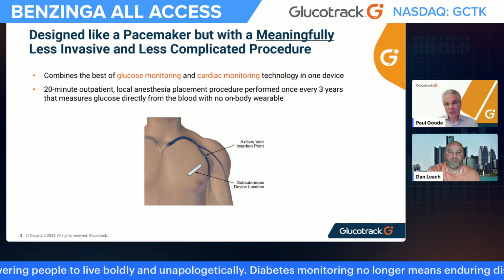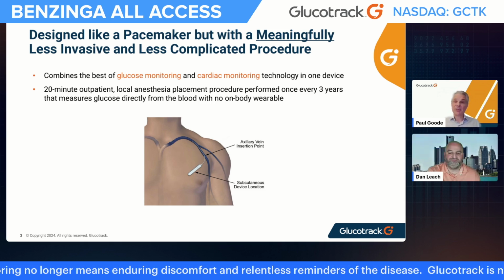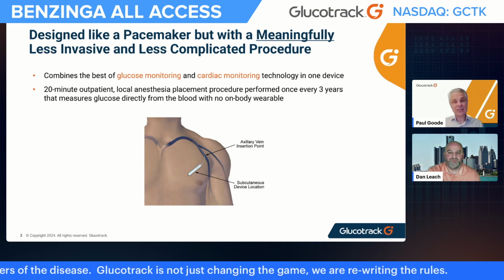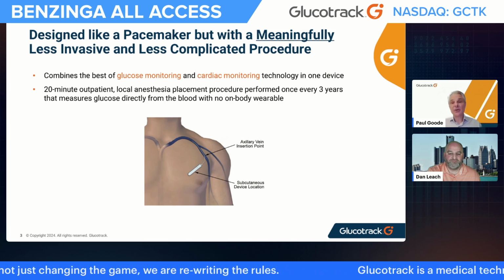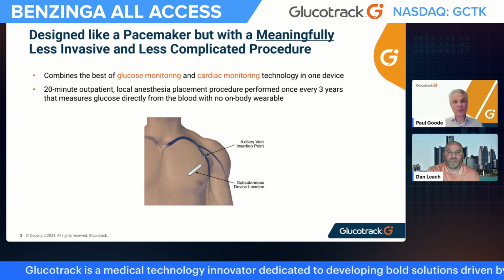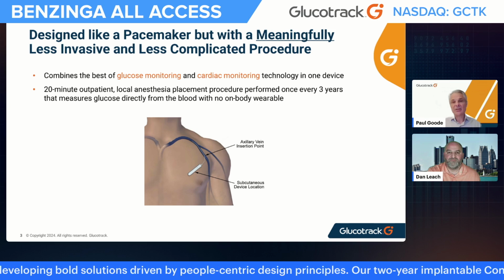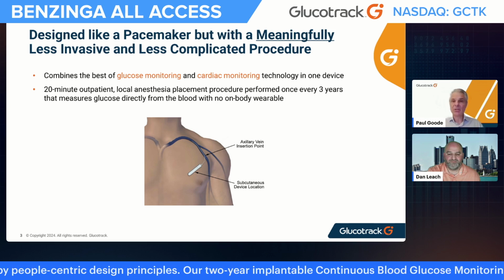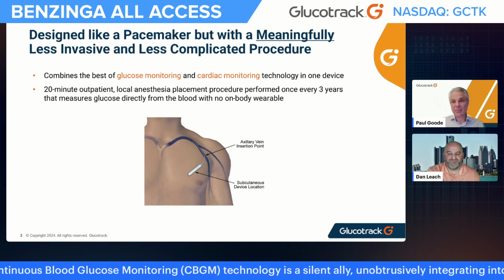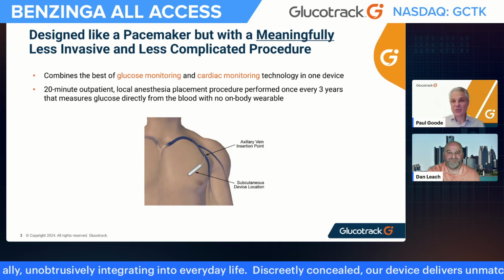So we did this small study down in Sao Paulo, and we found that we met our primary endpoint. Our primary endpoint was safety. We wanted to confirm that there were no device or procedure-related serious adverse events. We did that. The procedure was safe, but we also wanted to look at device functionality and the surgical technique. Did we need some special tools or not? We didn't need any special tools or anything different from what was typically used for these types of devices, or any special procedures. So we confirmed that, and we also had very good sensor function and very accurate readings, and we're going to be presenting the actual data on those at an upcoming diabetes conference in Amsterdam next week at the ATTD conference. So we're ready for the next step, which is the long-term clinical study.